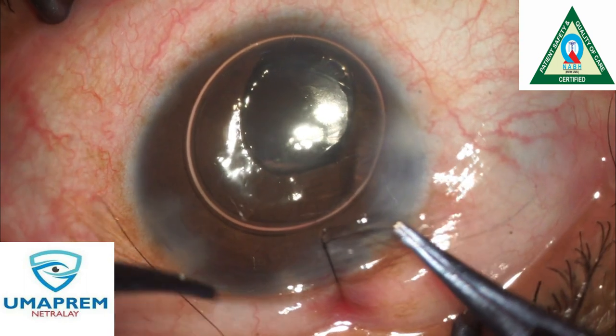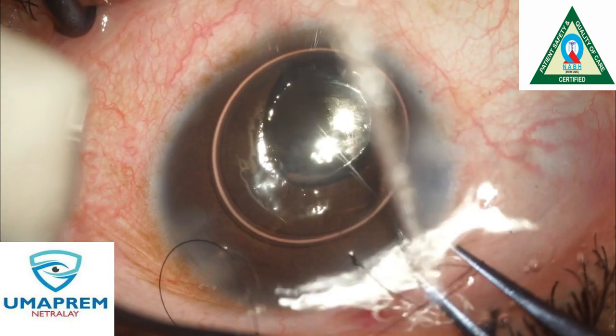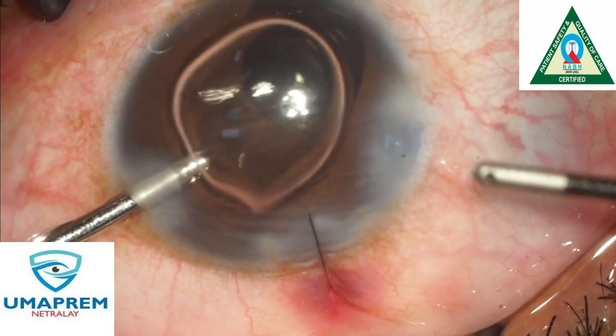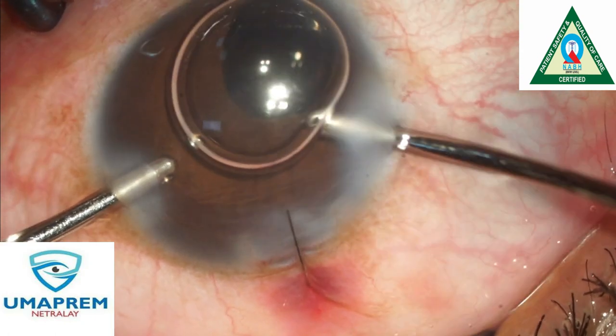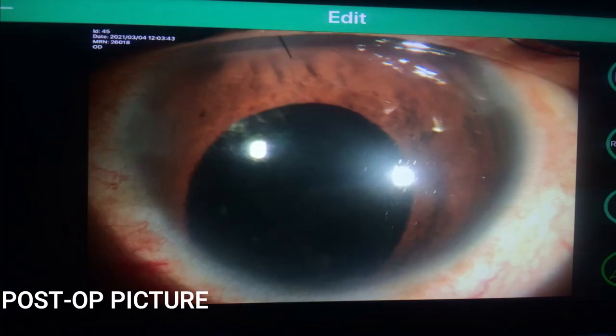Because this is a one-eyed patient, we place a suture — we do not take any risk. Since iris prolapse was present, we make a suture. This is the final picture — this is the postoperative picture.